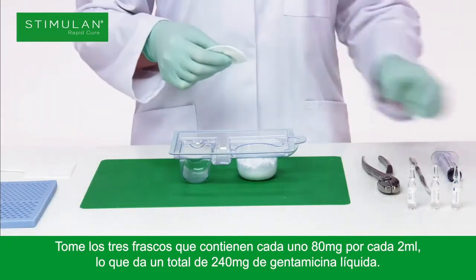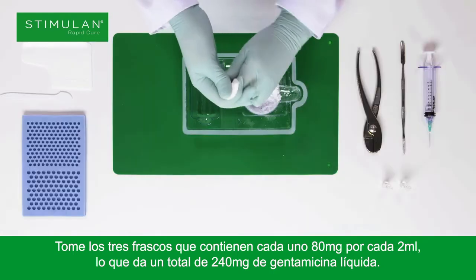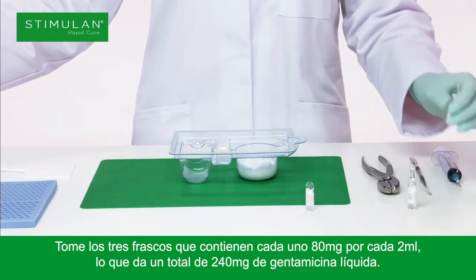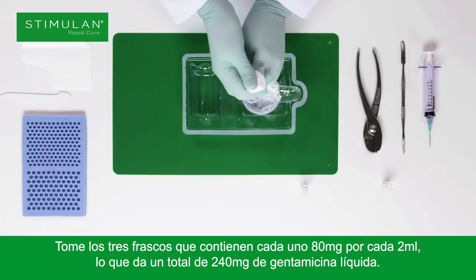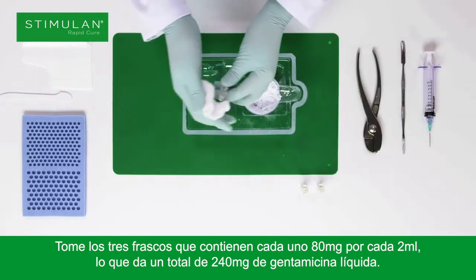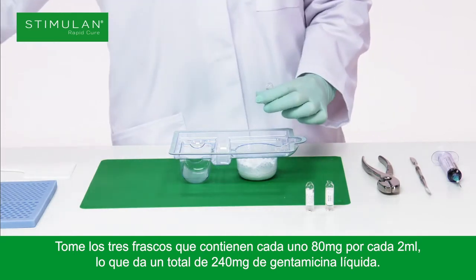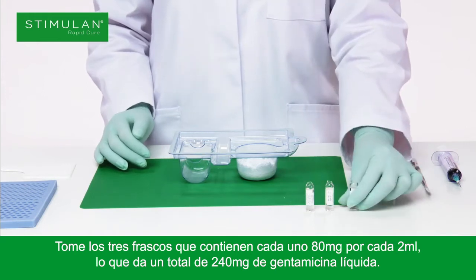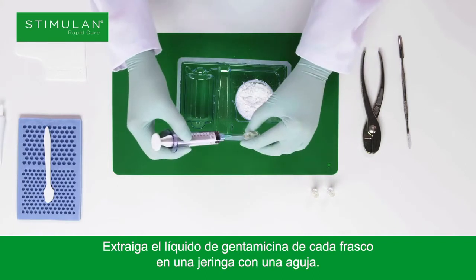Take the three vials each containing 80mg per 2ml, giving a total of 240mg of gentamicin liquid. Draw up the gentamicin liquid from each vial into a syringe using a needle.